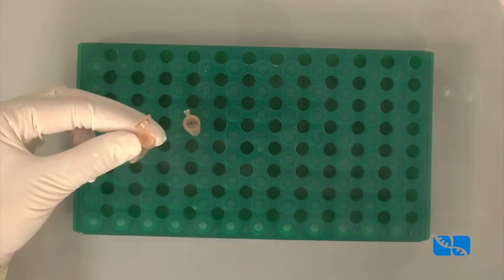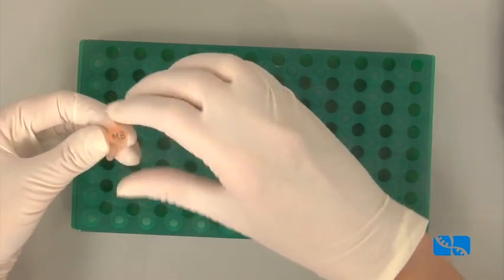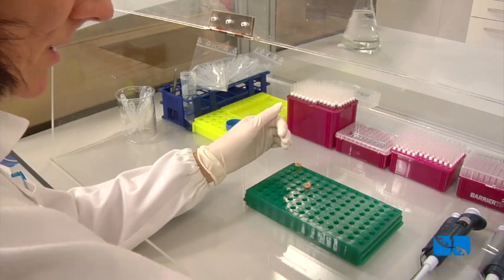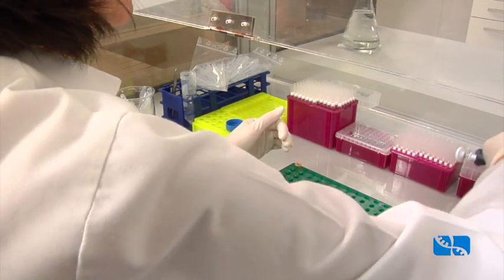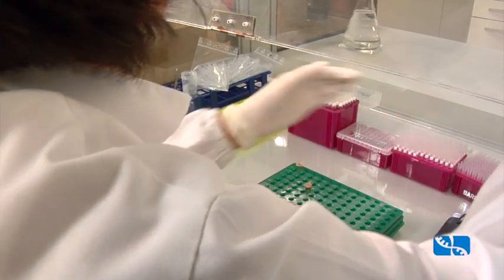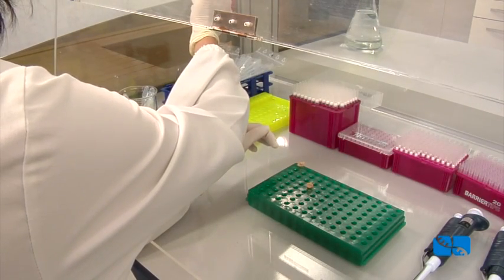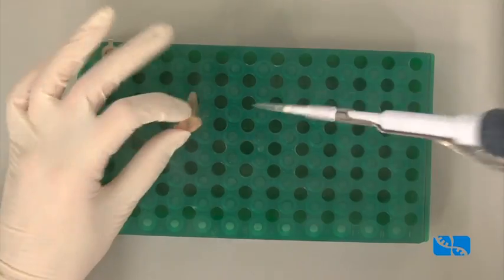These cells would be ready to continue with the PCR step. These samples can be stored at 4 degrees Celsius till performing the PCR, no longer than 5 days. For longer time, it is recommended to keep cells at -20 degrees Celsius.